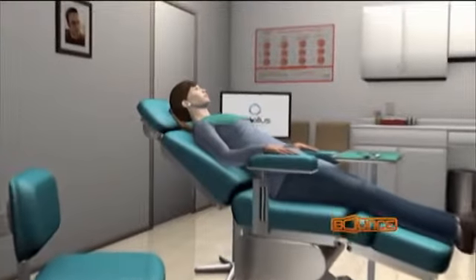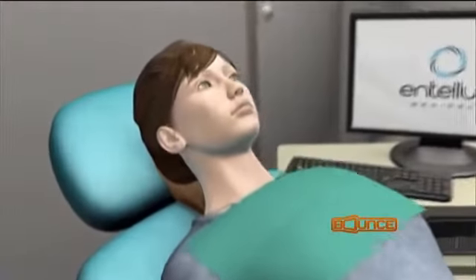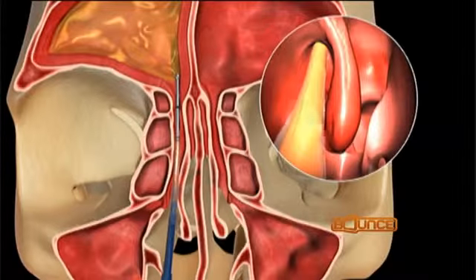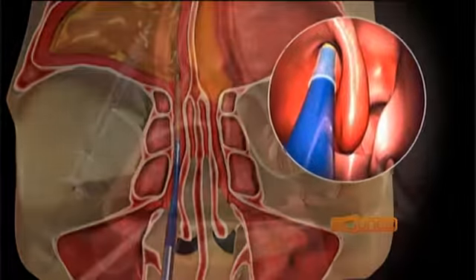Well, it can do a few things. It is a technique that takes the sinus openings that we have that for one reason or another become narrow or blocked completely, which leads to sinus infection. And this permits us, using a very simple technique that we borrowed from our colleagues in vascular surgery, to introduce a deflated balloon into the blocked sinus opening and then gently inflate this balloon to dilate the opening, and this does the job without creating tissue damage or tissue removal and bleeding and other things that involve much more of a healing process.